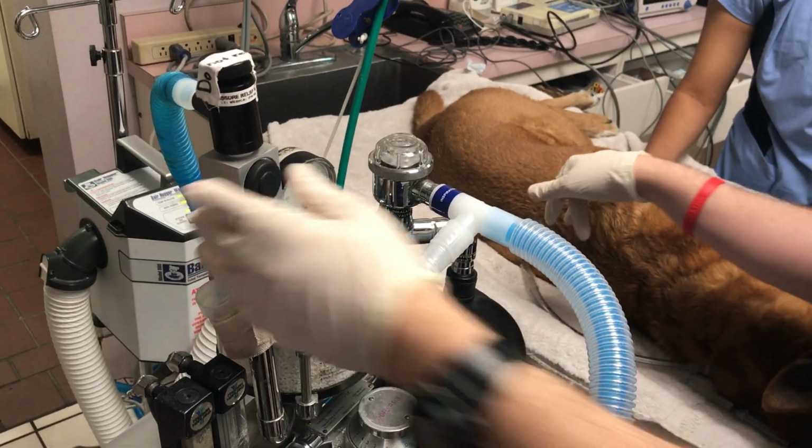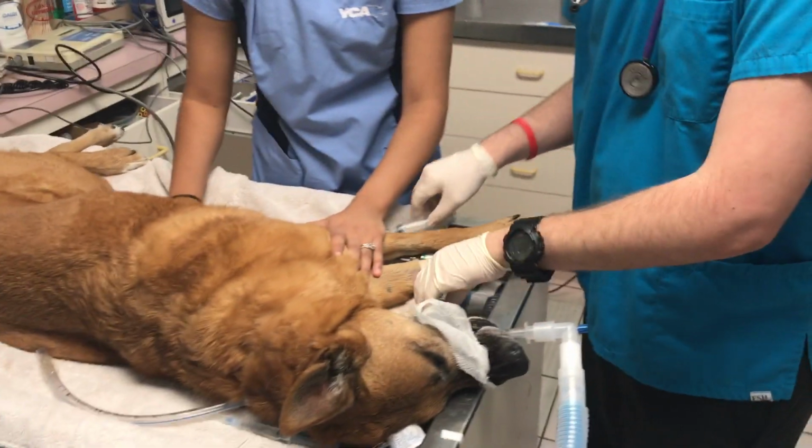Lungs are inflating when I give a breath. And that's how you place an endotracheal tube.